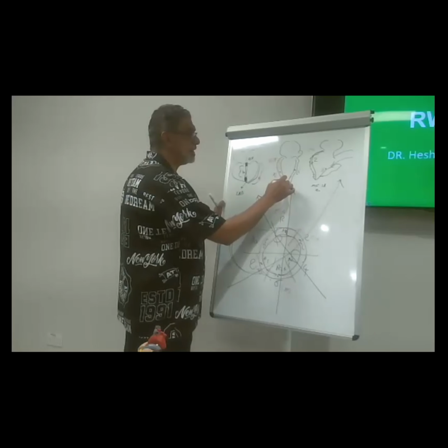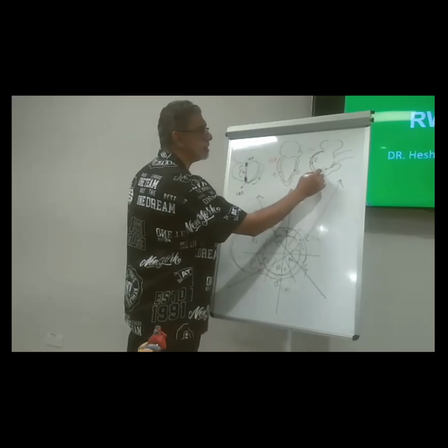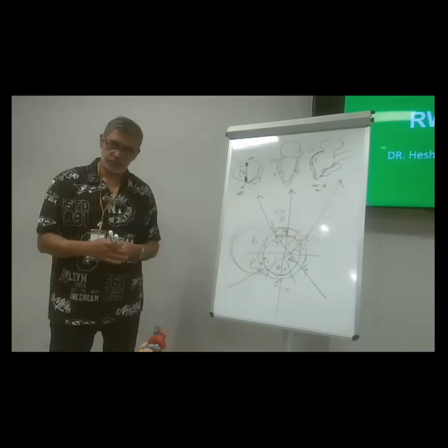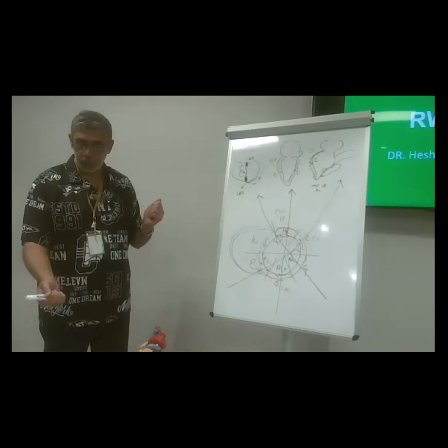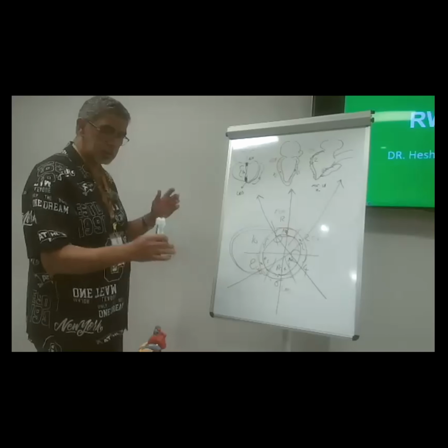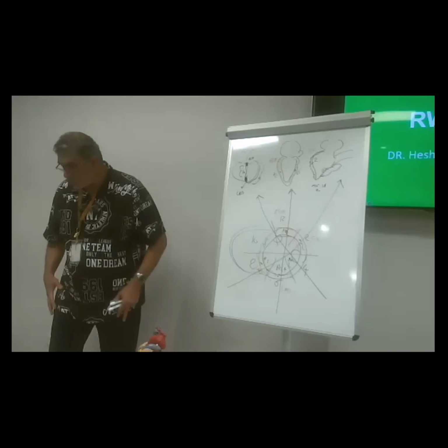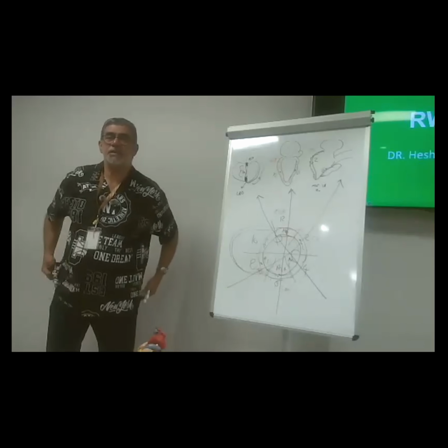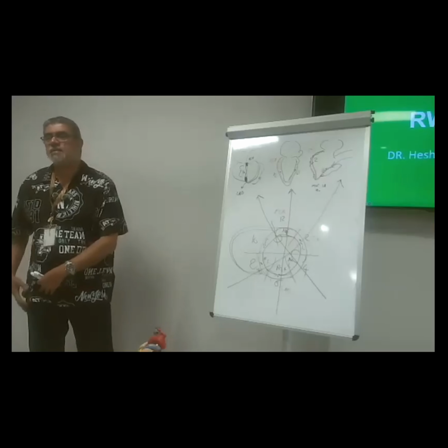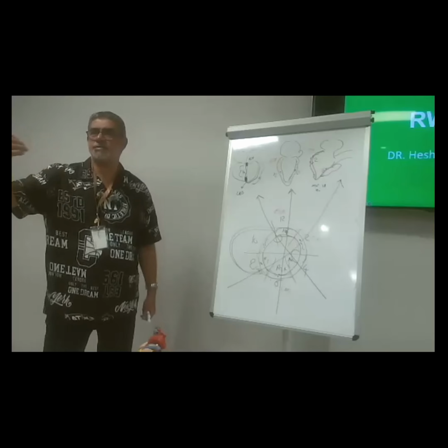6 is LAD. 8. Okay. You're holding the probe. I want you to check the regionality. There's a big difference between somebody looking for his case in his pocket, and another one who finds the case in his books. I mean, you have to train yourself for a targeted study.